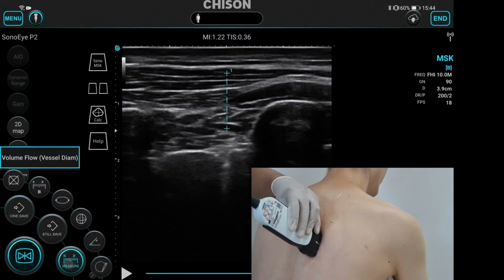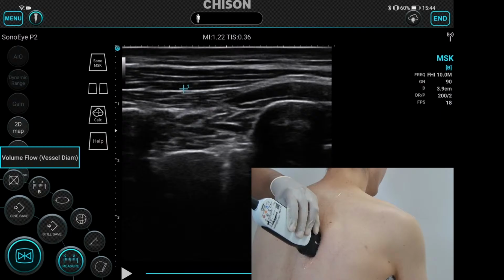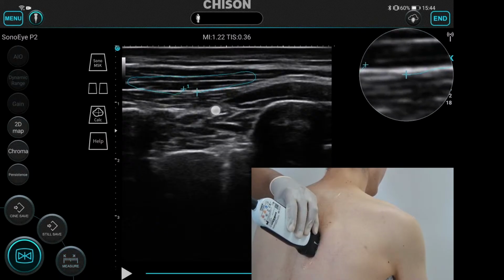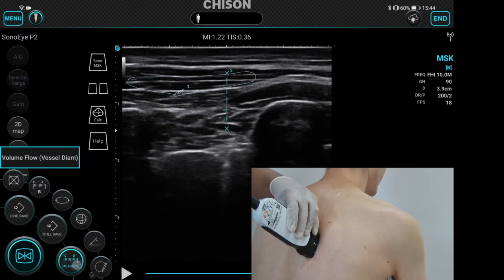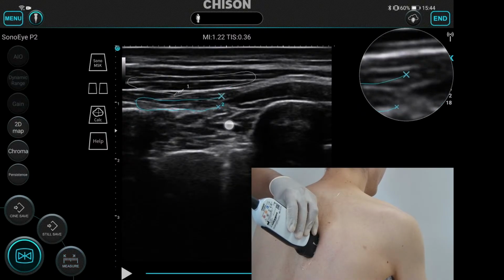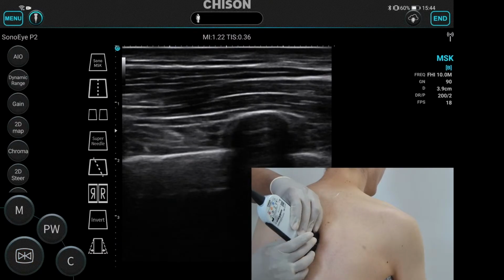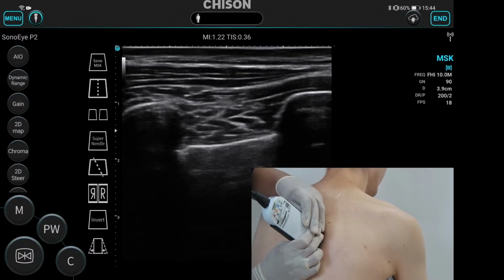The first one we have, this one over here, is the trapezius. Below that trapezius you have the rhomboid, this thin muscle. And now when I move from lateral to medial, you will see the third muscle coming, which is the group of erector spinae muscles.